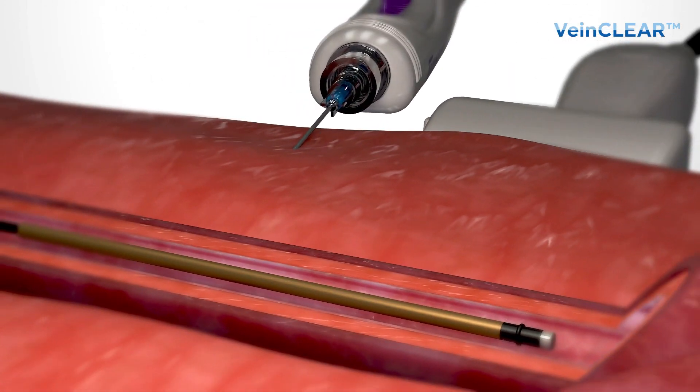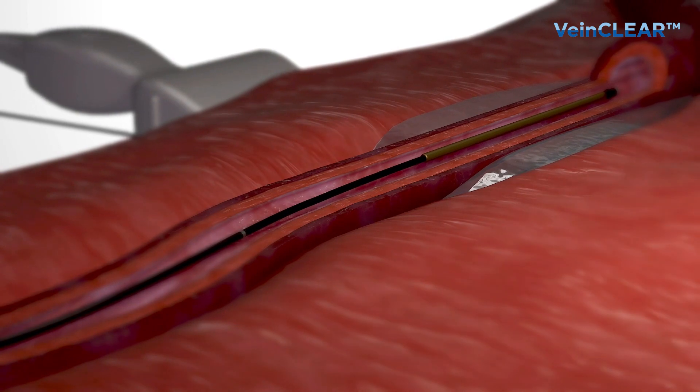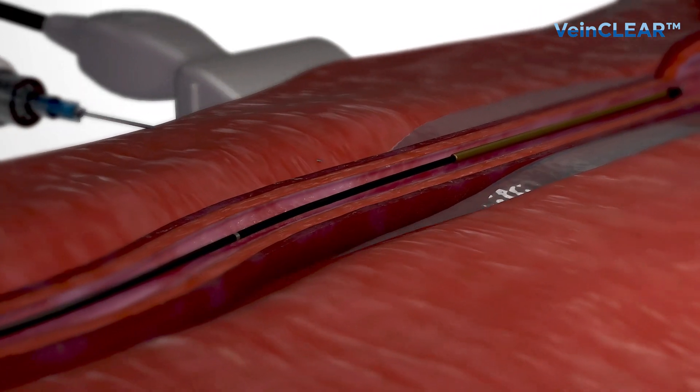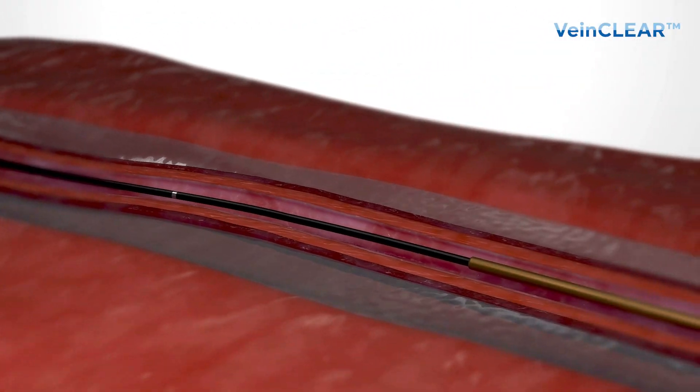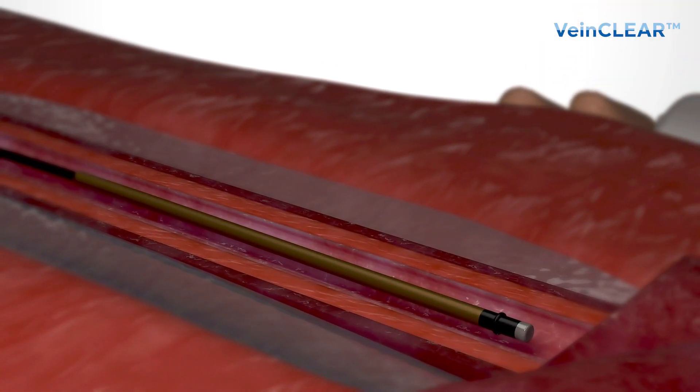Tumescent anesthesia is a method of infiltrating a tumescent anesthetic solution into the perivascular region in the fascia under ultrasound guidance. The tumescent anesthetic solution is infiltrated around the vein using a tumescentor handpiece.